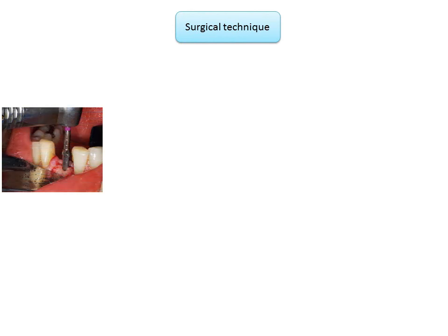Now, let's look at the surgical technique of implants. In brief, we shall just focus on the steps in a sequential manner. So the first step is the implant site exposure, wherein a flap is reflected. The exposure of the implant site can be accomplished by several methods, which include flapless surgery or tissue elevation, and can include circular, mid-crestal, and vertical releasing incisions.